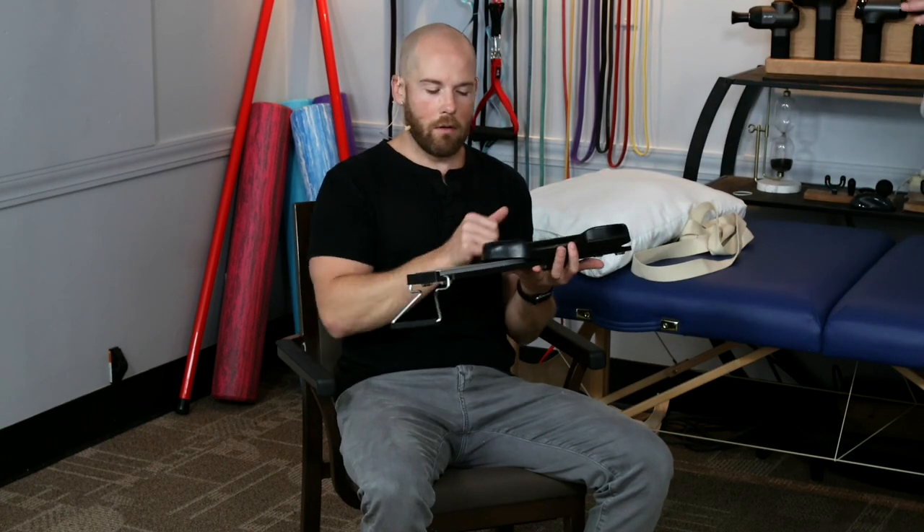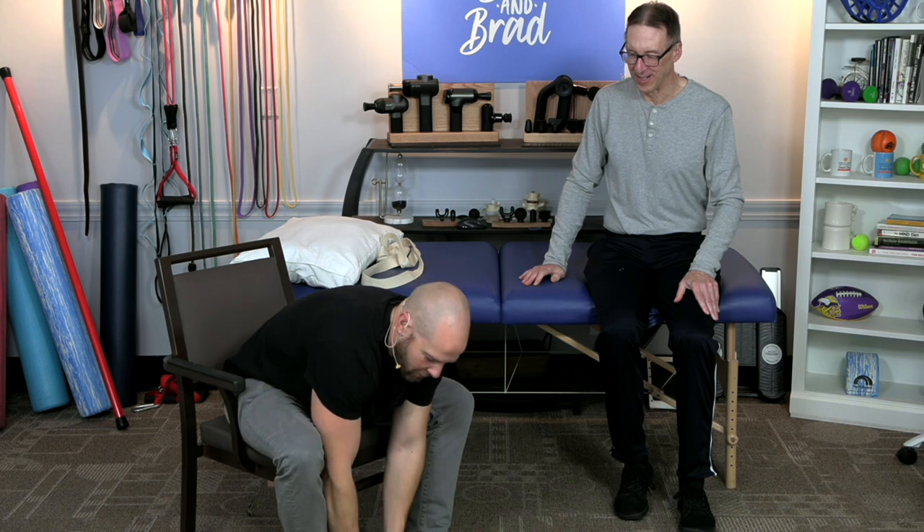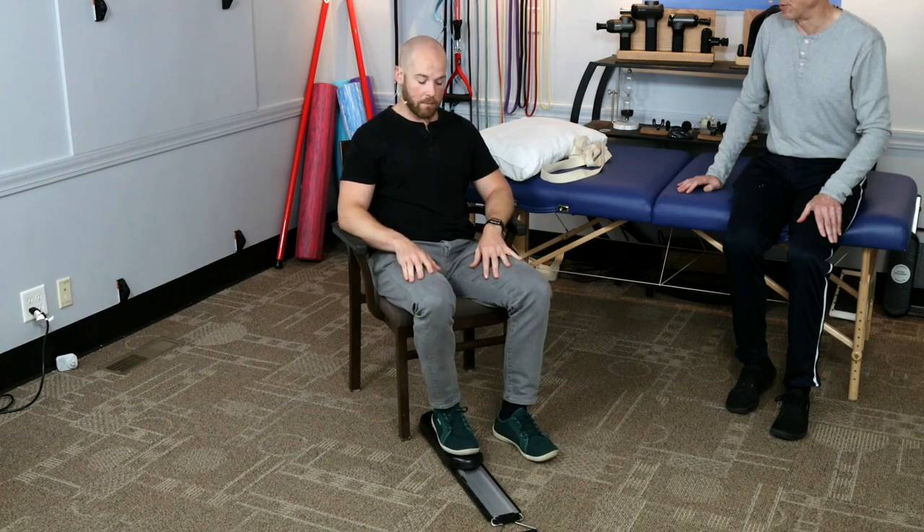Once you're done using it in bed, you can use it in a seated position. You can start with it flat like this and simply go back and forth with the surgical side. If it's too hard to move, you can use your other leg to help bend it — so if you had a knee replacement, it's really smooth.